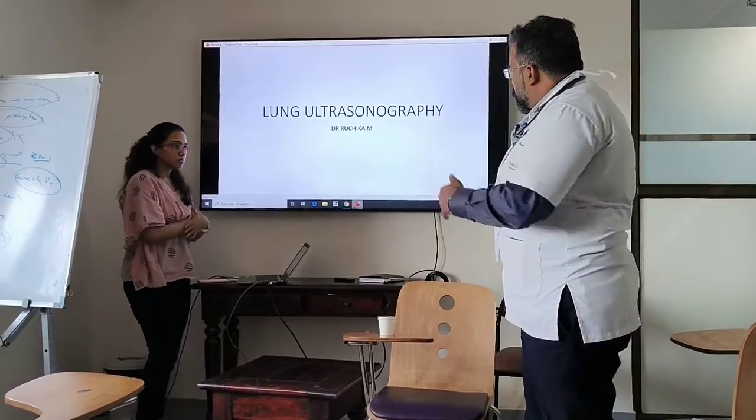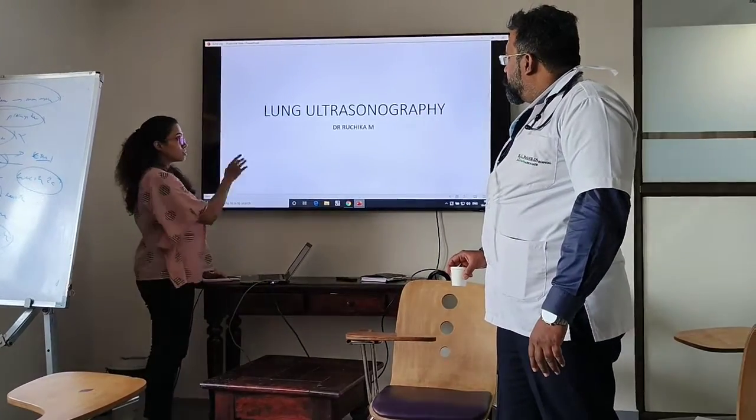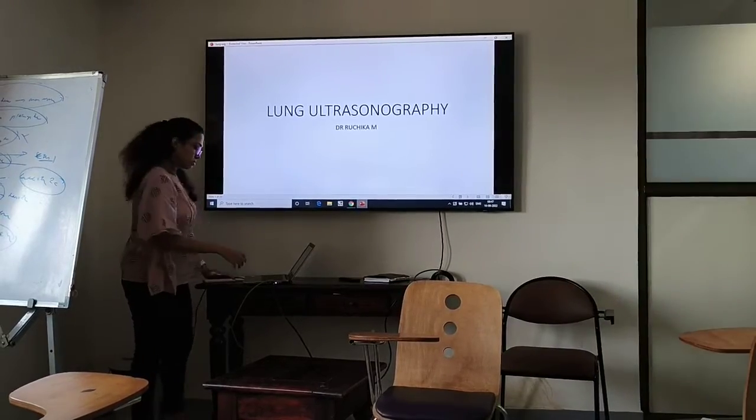Okay, so let's go to lung ultrasonography. Do you have the diaphragm after this or now? In the end, I have diaphragmatic excursion. Okay, let's do it.